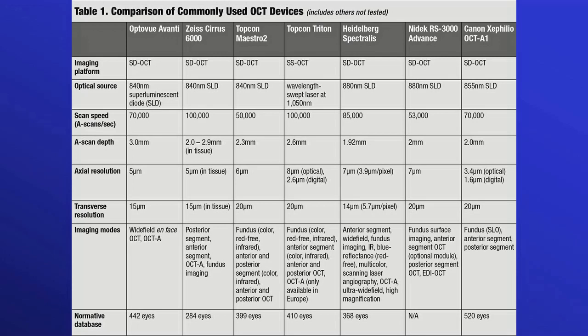Finally, this table shows the differences between some of the modalities of the different OCT machines.